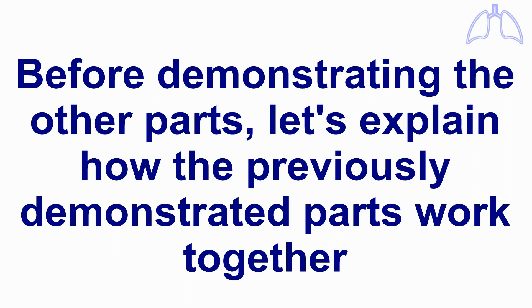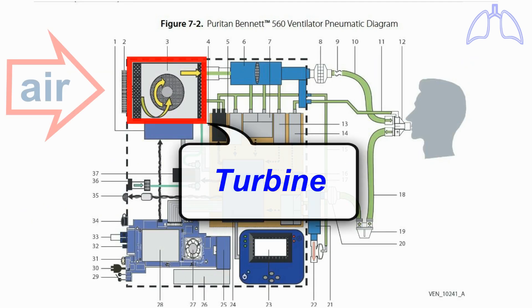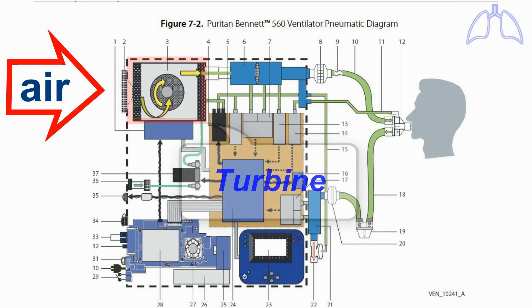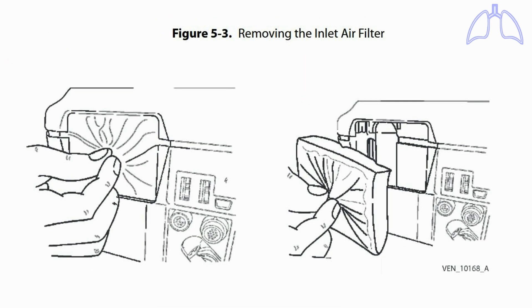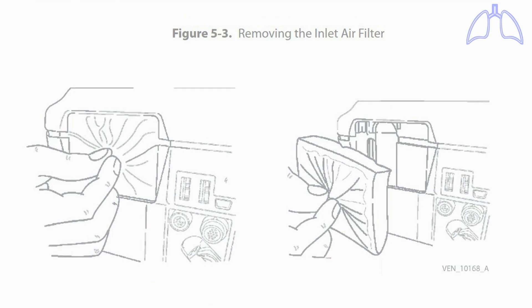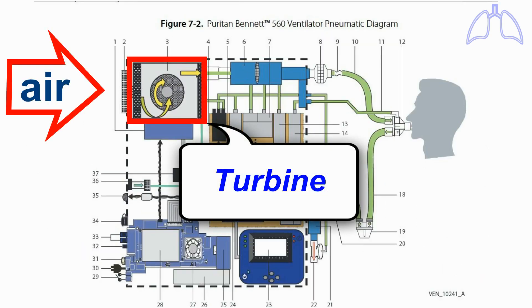Before demonstrating the other parts, let's explain how the previously demonstrated parts work together. The turbine draws in air from atmosphere. The air flows through the air inlet filter, which is a replaceable air filter, then it flows to the turbine.